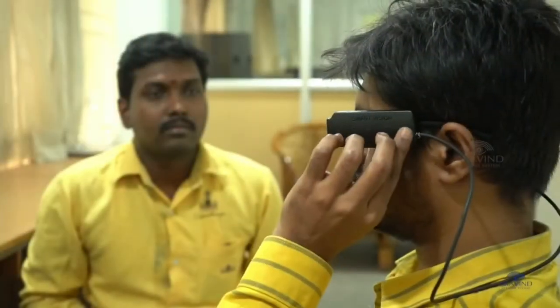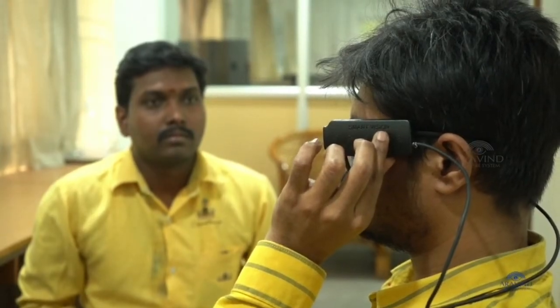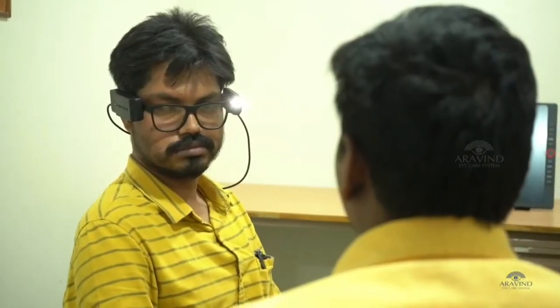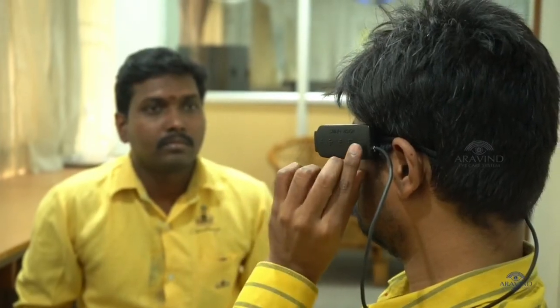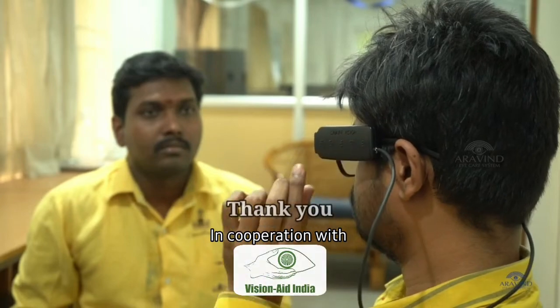By pressing the letter F in Braille, the device will be in facial storing mode. This will allow saving faces and names as a contact list. After a tap to record, the name 'Jack' is entered, and tapping to save stores Jack's picture. Picture saved.